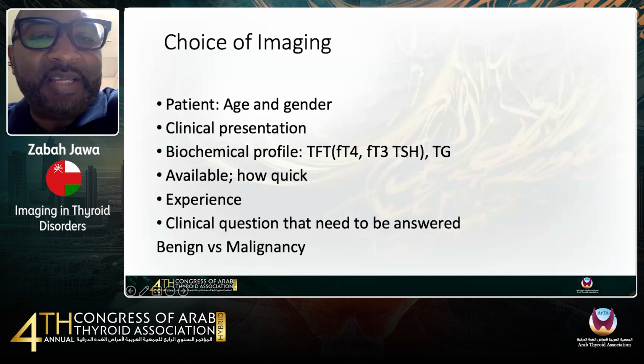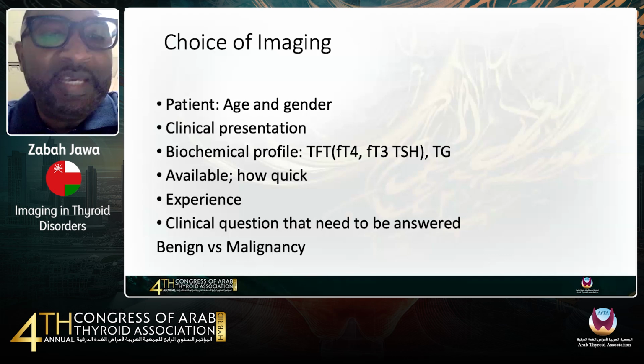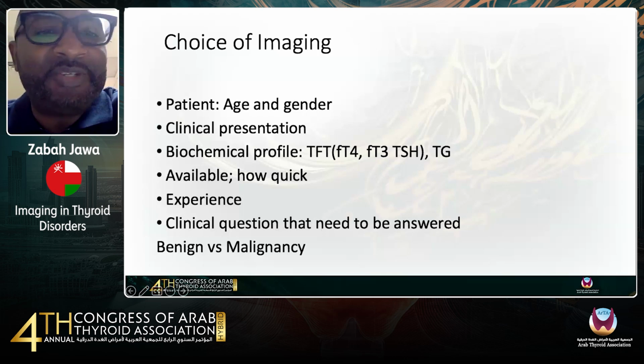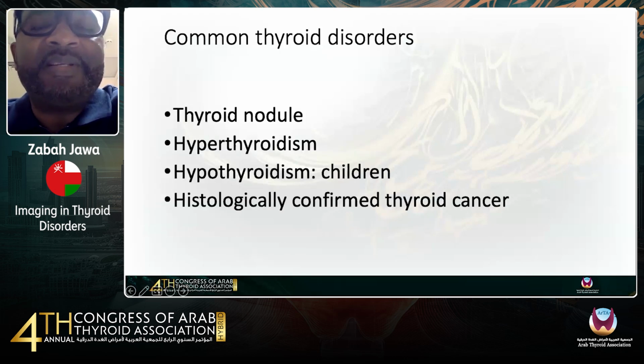But the key important thing is that before deciding on any imaging modality for the thyroid, it is important to know what the most important clinical questions are that need to be asked, bearing in mind those factors. Is it a benign disease or is it a malignant disease? So let's look at some of the common thyroid disorders that we find in our day-to-day practice.